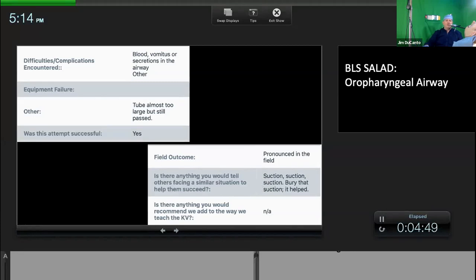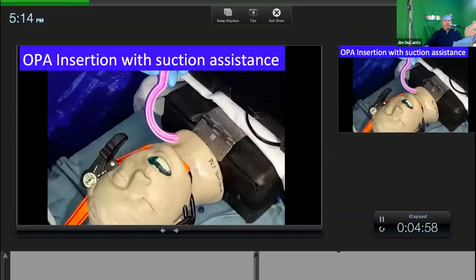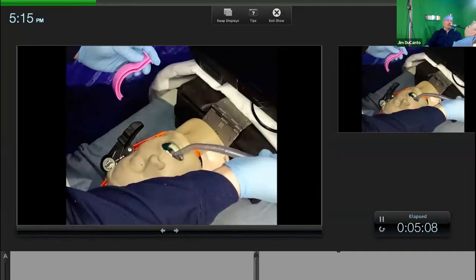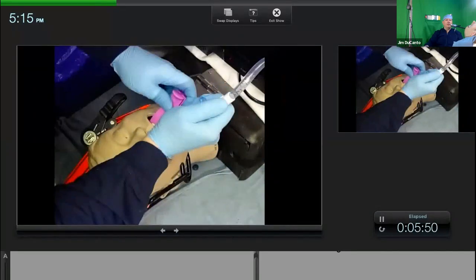I'm going to go through a slideshow now that shows the SALAD technique in pictures in a mannequin. We're going to show a contaminated airway, and this is a Berman oral airway. I'm going to be placing this oral airway with suction assistance now. I'll begin using a large bore suction catheter. This is the Ducanto suction catheter from SCORE. I'm going to start out holding the suction catheter upside down. I don't hold it in the normal fashion. I hold it upside down, basically in the same contour as you would hold a laryngoscope.